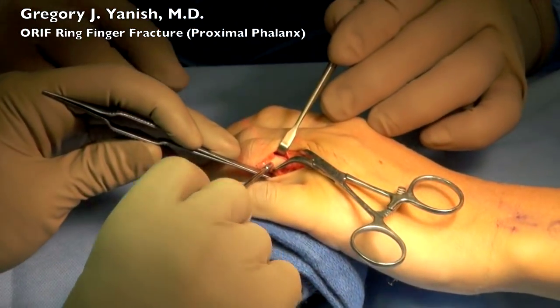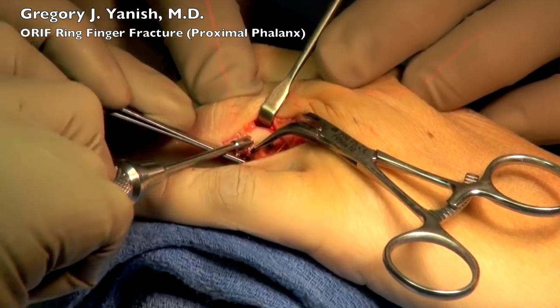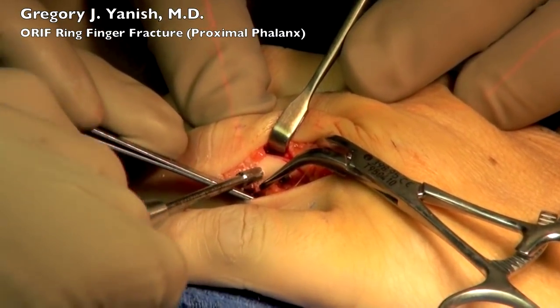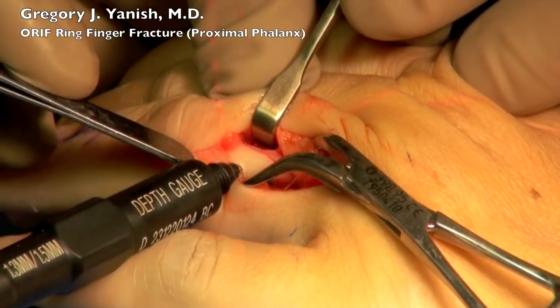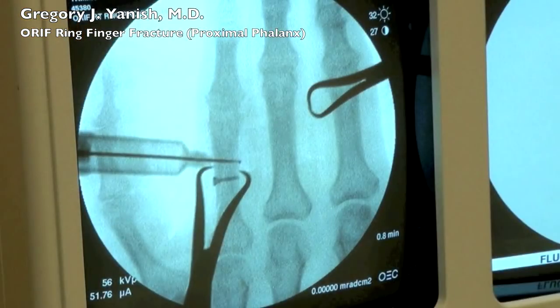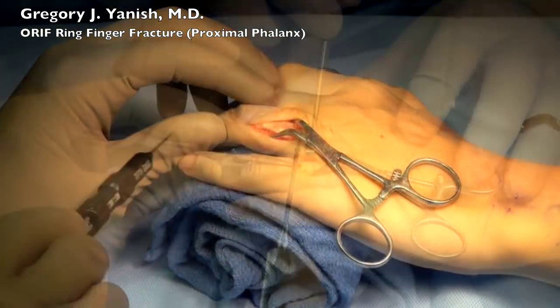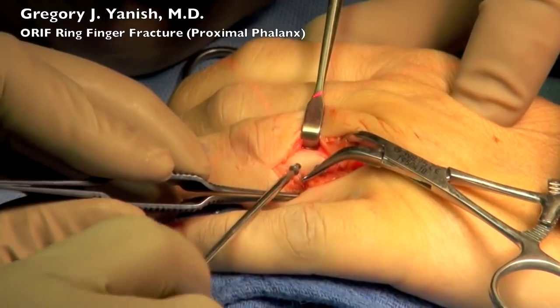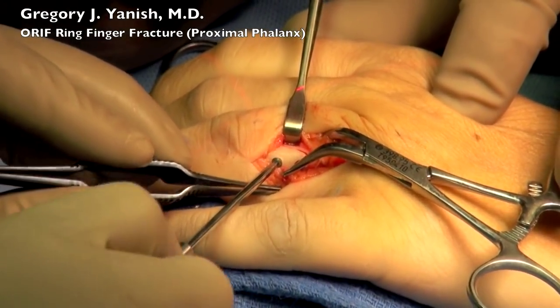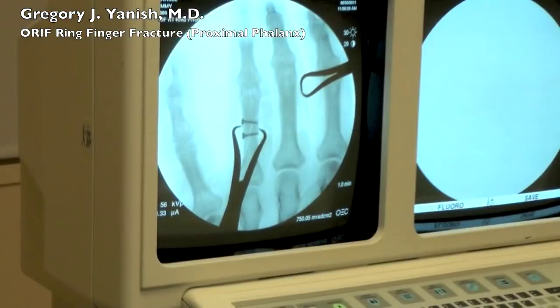This particular screw hole I'm doing by hand for a little bit finer control. Then we'll use the countersink, which wasn't shown on the first screw — that makes the bone a little bit wider where the head of the screw will be so the screw can seat down nicely. Then we'll use the depth gauge to measure the length of this screw and confirm that on fluoroscopy. That's then carefully removed and we'll place our screw. This screw is also seated quite nicely and is confirmed on fluoroscopy.